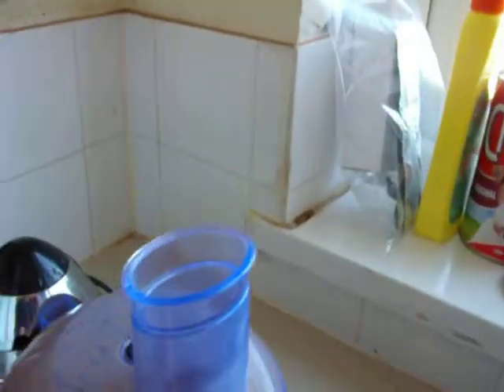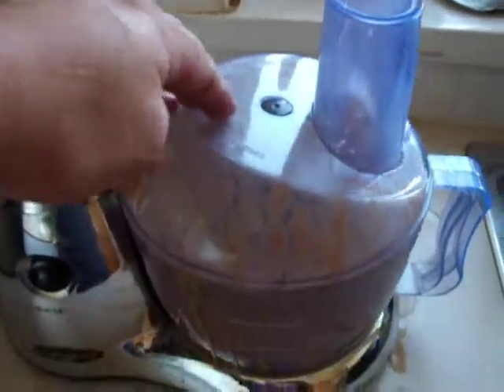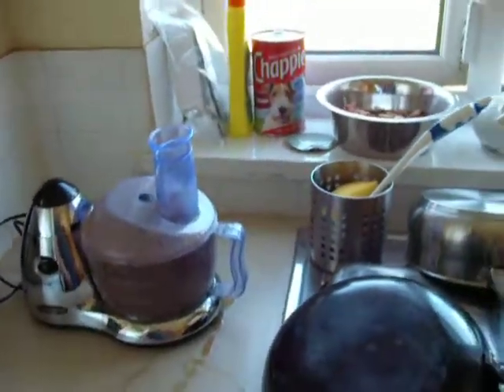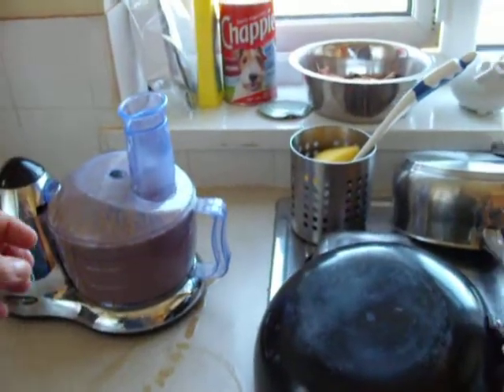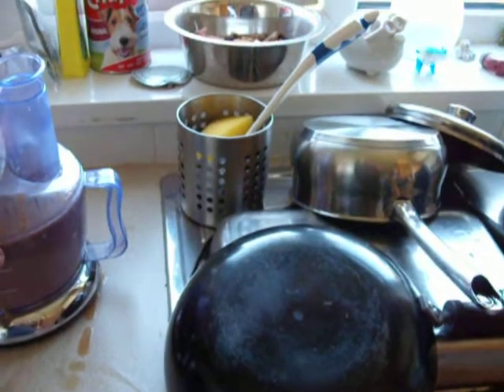Once they're in place, about 10 minutes to do. The longer it gets in there the better really, because it has to be very, very well mixed obviously, to allow it to go through the tube.